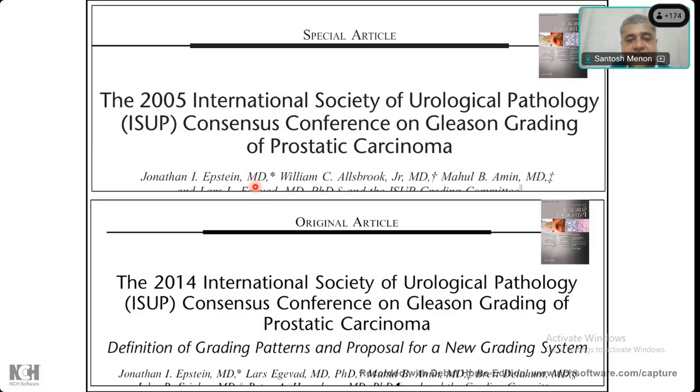Now, this is the original one. Please do not get confused with the current or modified Gleason scoring system. In the original one, even the cribriform, papillary and fused glands were all under pattern 3, which is no more the case, and we will discuss it later. Any questions on this? You understand what is cribriform, what is papillary, complex papillary? This is the 1966 diagram which I am showing you now. You understand?